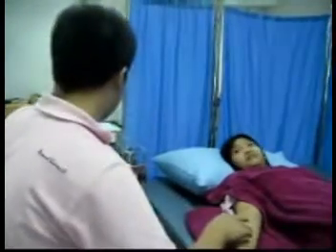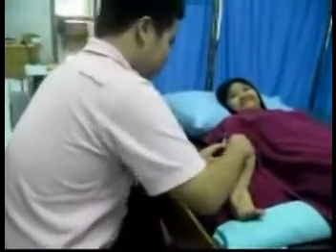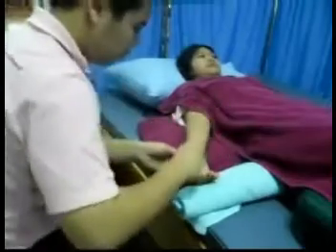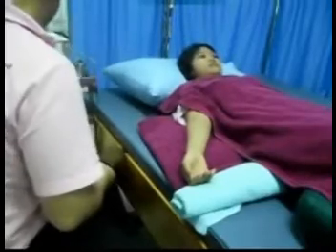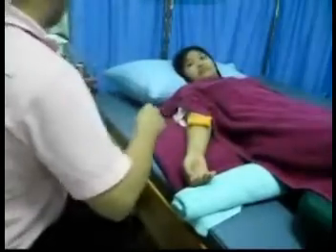We can treat in 4 steps for the monopolar technique. 4.1 Press the positive electrode at the outer area on the same side of the body. 4.2 Cover the end of the point electrode with cotton and connect it to the negative electrode.